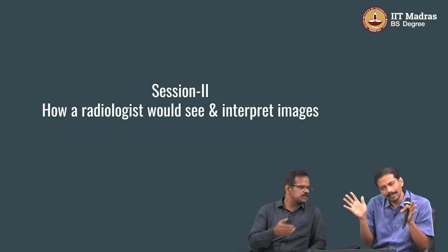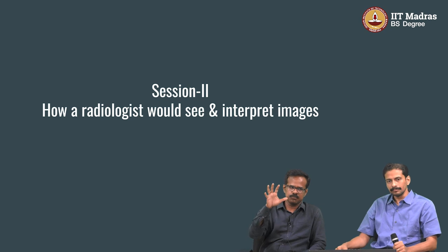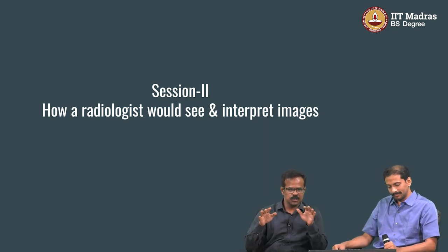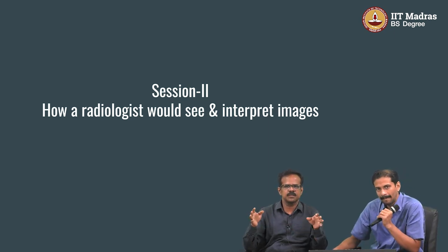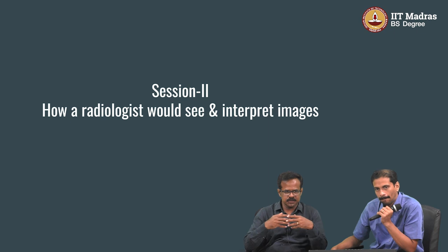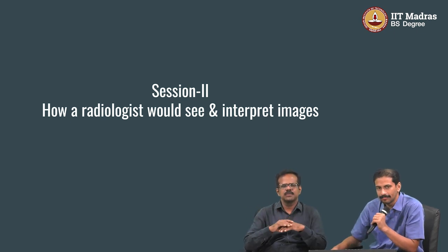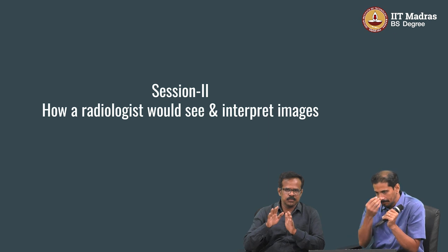They are negligible. There is a parameter for that called SAR, specific absorption rate. Every scanner, 1.5 or 3 Tesla, will have that. But before a machine comes into the market, these are all studied by the regulatory authorities. Only permissible levels of SAR are allowed into the market. So by and large, from a public point of view, it is safe. For some particular patients, such as early pregnancy, we may sometimes avoid the MRI scan, if possible.